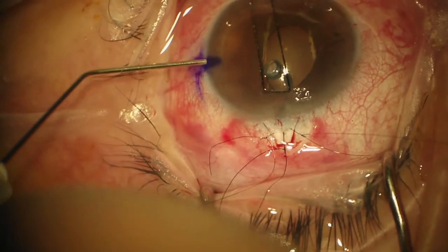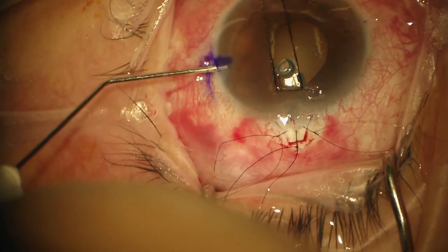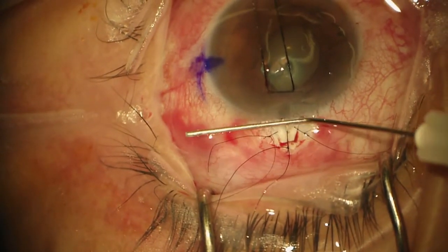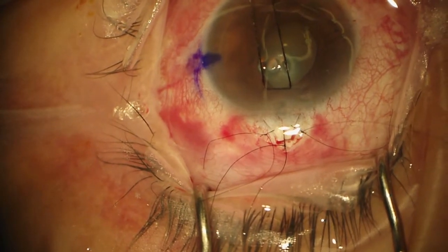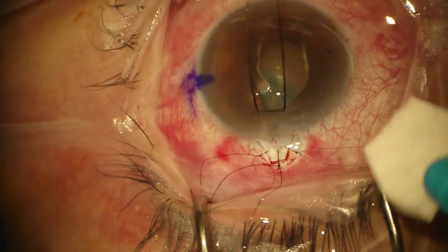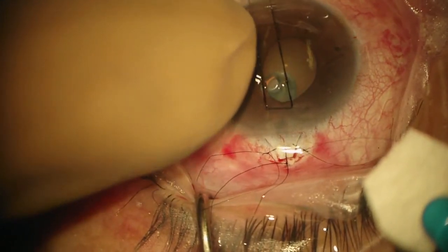Now we're going to evaluate how much flow we have. I put BSS in the anterior chamber. First thing I do is make sure that I can maintain a chamber — she has a nice deep chamber. I'm going to press on the eye and feel — oh, the eye actually feels a little bit firm. There's not enough flow for that high pressure.